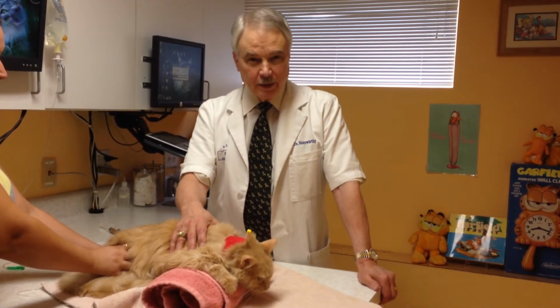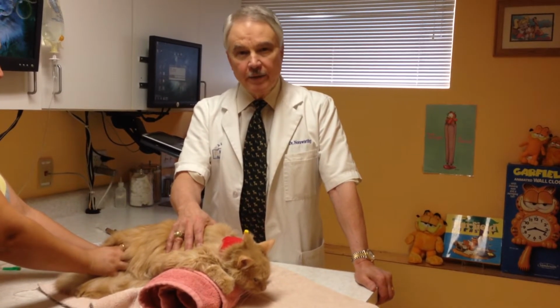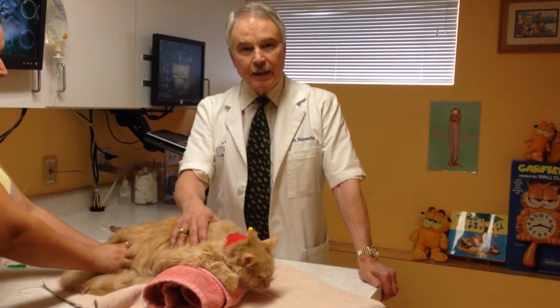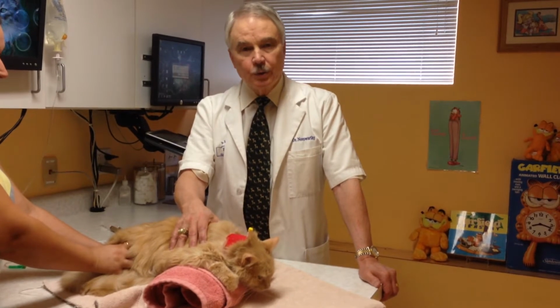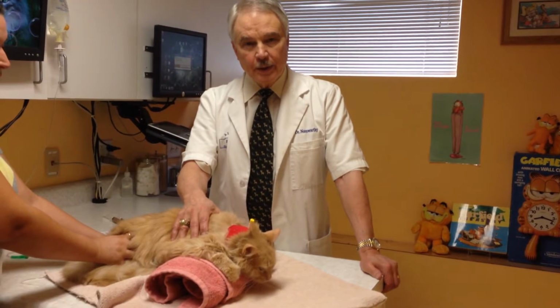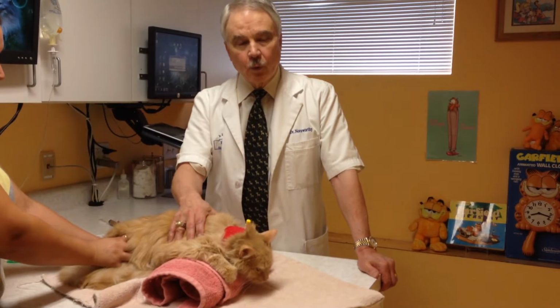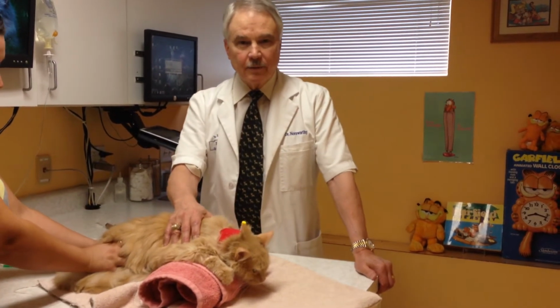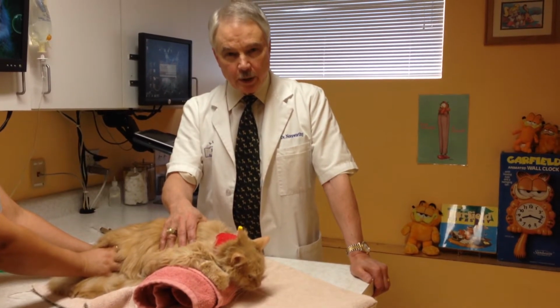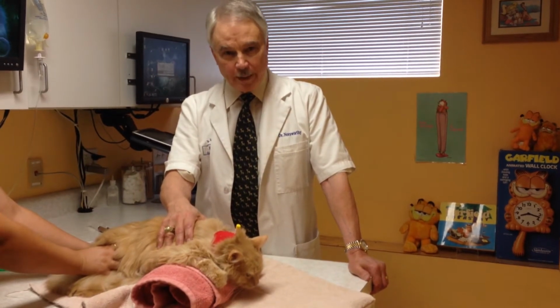There's a valve at the end of the esophagus that opens to let food go into the stomach, and then it closes to keep gastric acid from refluxing back into the esophagus. If the tube goes all the way into the stomach, that valve stays open and we end up with some gastric reflux. Therefore, because the volume of the esophagus is much less than the stomach, we have to be careful that we don't put too much food in too rapidly.